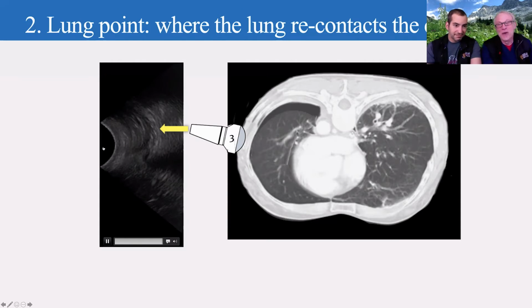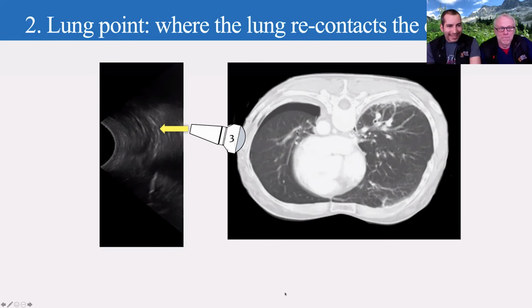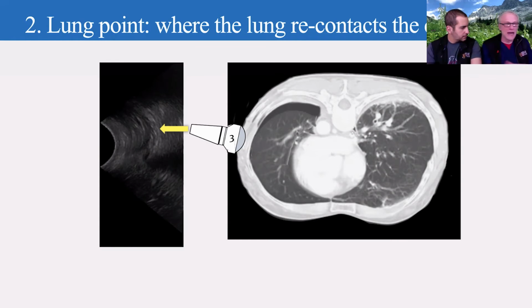Okay, Dr. Chalhoub. We've turned the image sideways just so it makes it a little bit easier to understand how that's lung sliding up and down. So it's essentially an intermittent glide that we're seeing there. Yeah, it's a partial lung sliding across part of the image. Okay, because a lot of people think any lung sliding rules out pneumothorax. No, partial lung sliding over half of it when you're at the lung point actually rules in pneumothorax. So it's the actual point where you're seeing the two pleura recontact each other. That is correct. Actually, we get the hang of it.